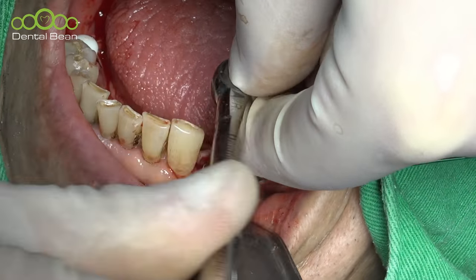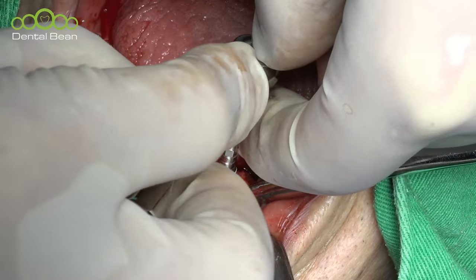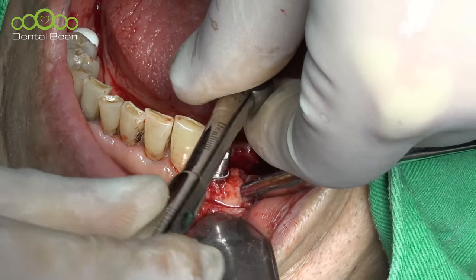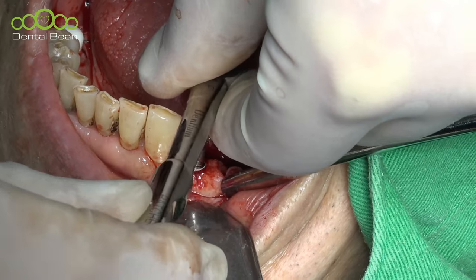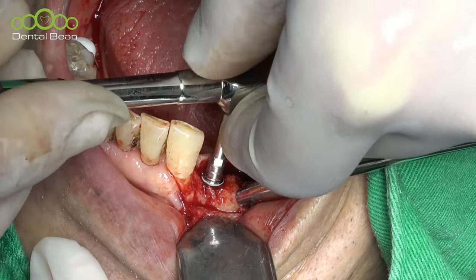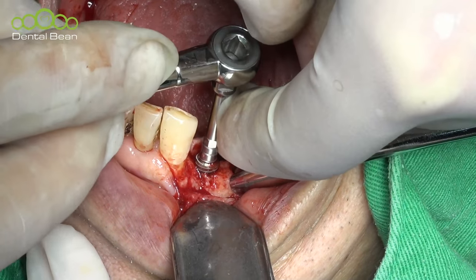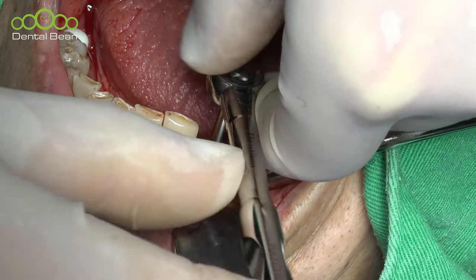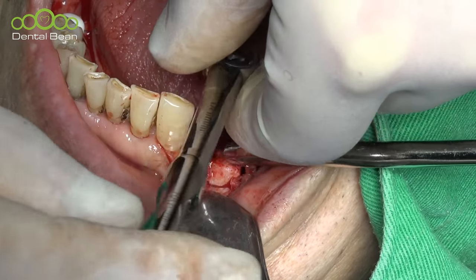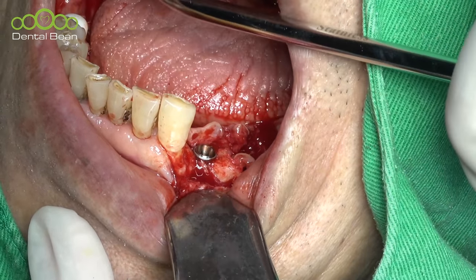Reverse. Retry. One more retry. Reverse. Usually the SLA surface maximum 2 times. Reverse torque is good. Maybe optimal 20 or 25 is good. Okay, next one, second implant.